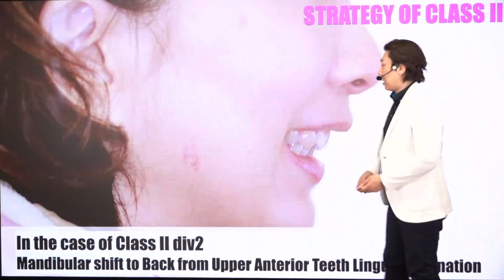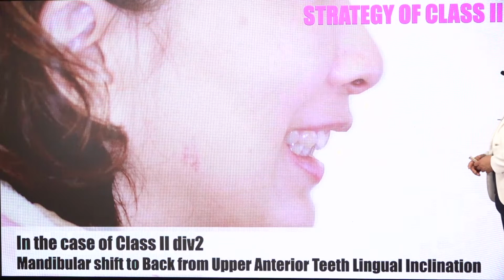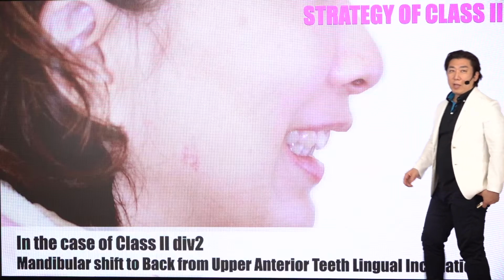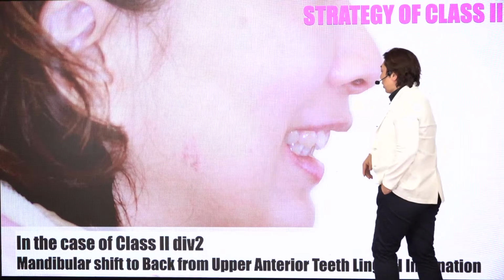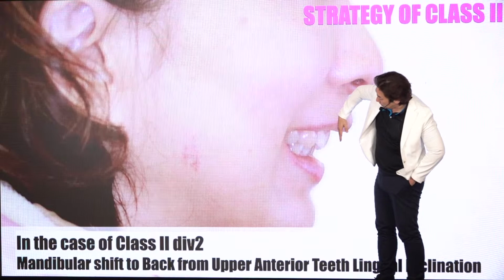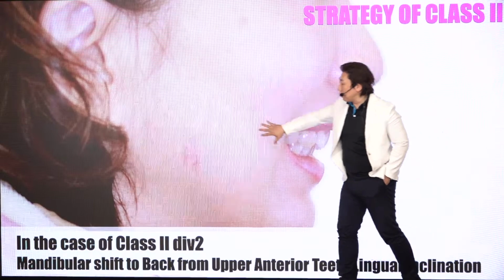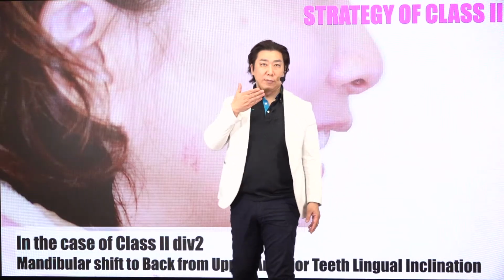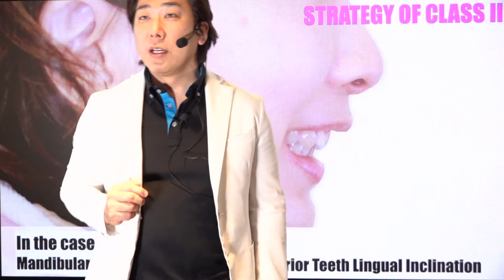Please have a look. In this case of class 2 division 2, the mandible shifts to the back from the upper anterior teeth lingual inclination. Many class 2 division 2 cases are like this situation. The upper anterior teeth have a very severe lingual inclination, so many times the patient's mandible is shifted to the back. We have to check this point. This is very, very important.